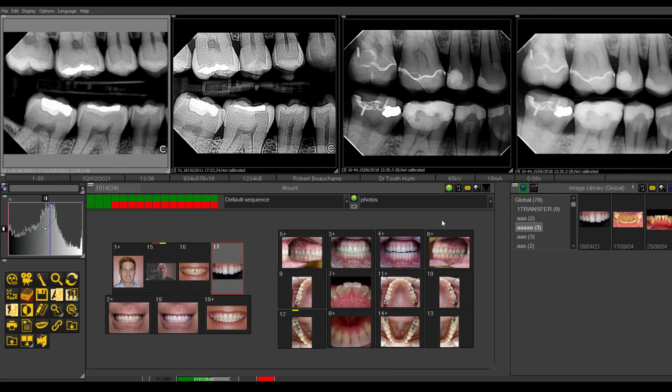So important that on your new patient questionnaire that you add that images acquired, in your file, may be utilized for educational purposes, and to get consent from patients to utilize their images. That would be an important element to incorporate into your new patient questionnaire or new patient information. And then you can then have the freedom to start to use these images to educate and enroll patients and show them different scenarios.